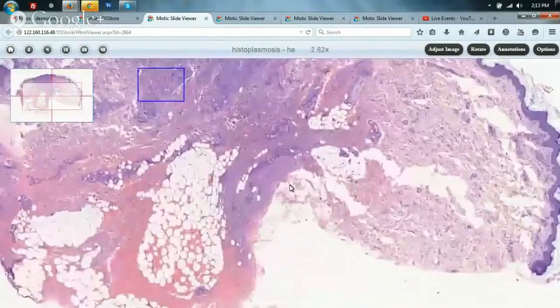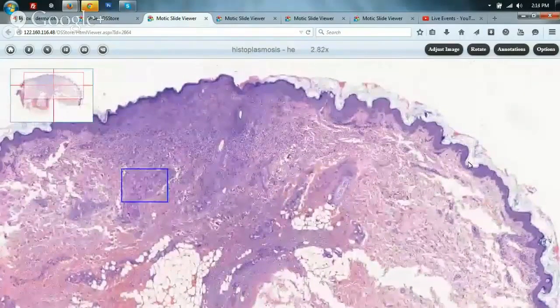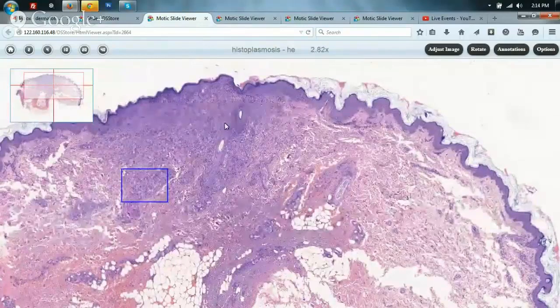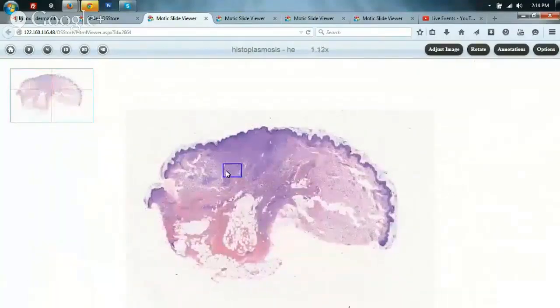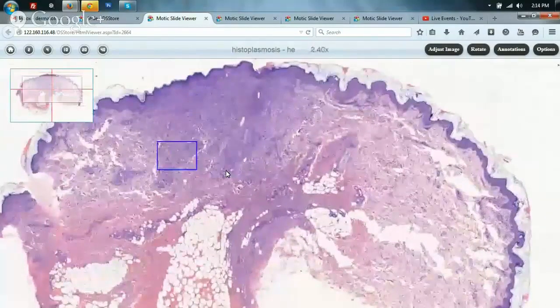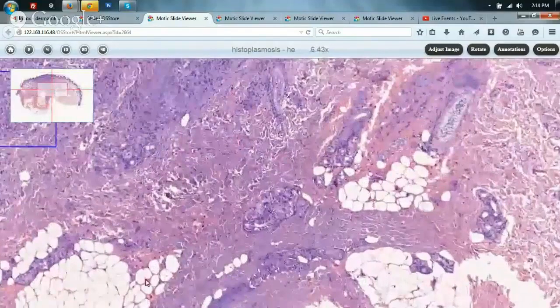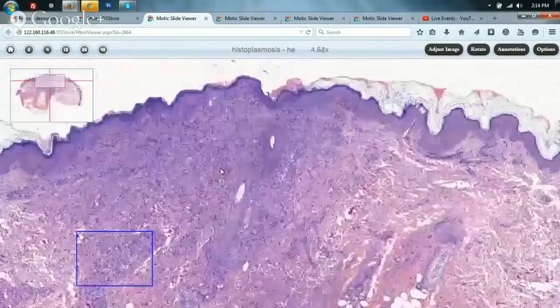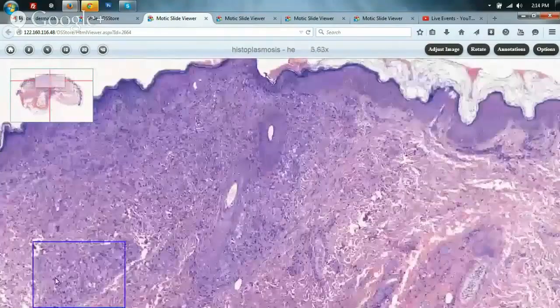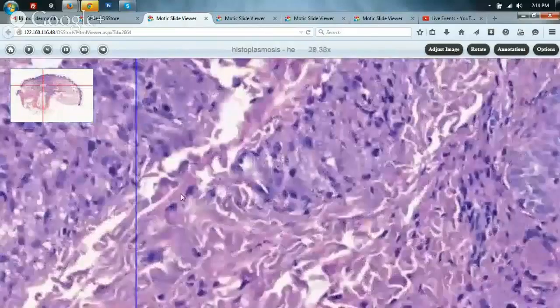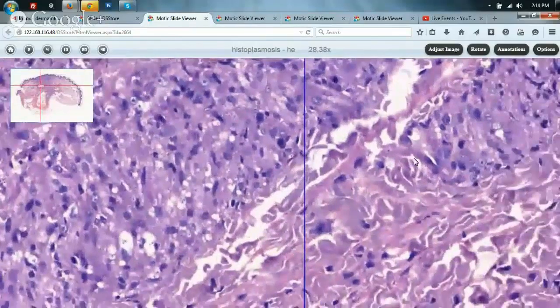In this picture we see the epidermis relatively normal with a little hyperkeratosis in places, and a dense infiltrate occupying almost the entire dermis, extending partly into the subcutaneous tissue. In the dermis we see a collection of lymphocytes, plasma cells and a large number of macrophages. It is the cytoplasm of these macrophages we must examine. What we see is a granuloma — as the books say, the more granulomatous the histopathology, the less likely one is to find organisms.